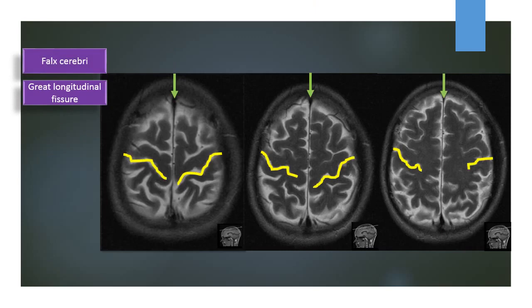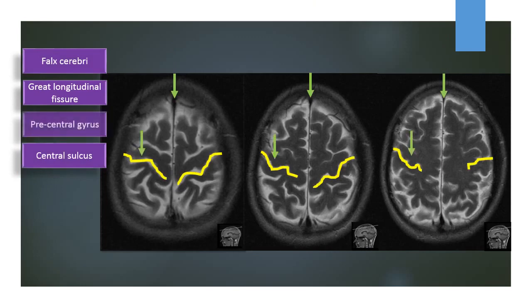The yellow lines indicate the central sulcus. The gyrus located in front of the central sulcus is the precentral gyrus, which is the primary motor cortex. The gyrus located behind the central sulcus is the postcentral gyrus, which is the primary sensory cortex.